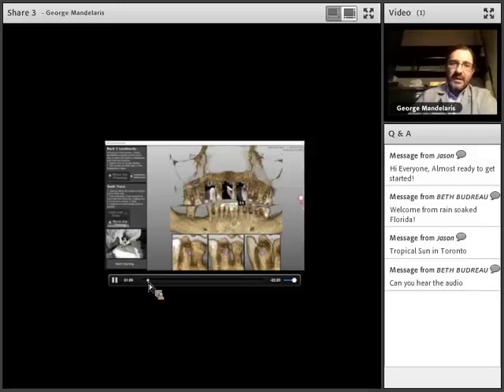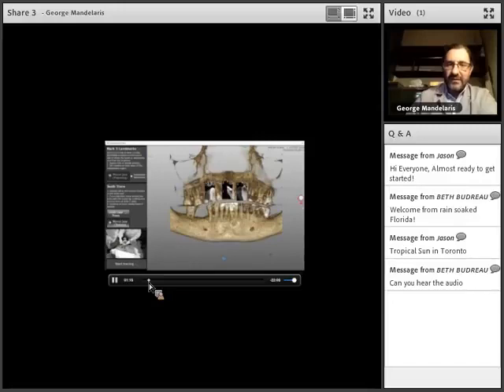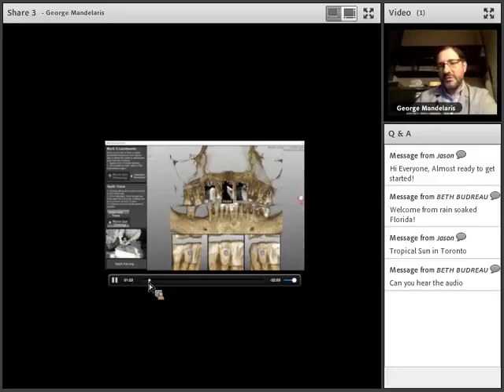Once that's complete, she'll then go ahead and move to tooth number 2, and then she'll move to tooth number 3. You'll hear almost like a video game sound, like you're at the next level, and it'll take you to the next phase, the next stage, to then do an accuracy check and move to calibrating your drill tip. So here's Sylvia basically doing the second tooth.